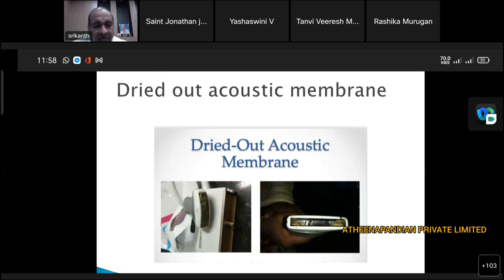This membrane also has a quality to be met, since it has to pass through the human body and let the ultrasound come through. There is a standard value for that also. Those things have to be taken into consideration before giving it for service. Next one, madam.